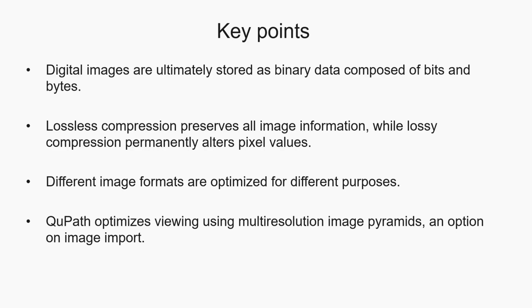Finally, technologies such as chunking, lazy loading, and resolution pyramids allow software like QuPath to efficiently navigate images that would otherwise be too large to load into memory. Understanding these concepts will help you choose appropriate file formats, preserve image quality, and build scalable image analysis workflows.